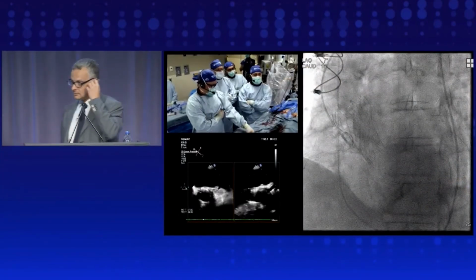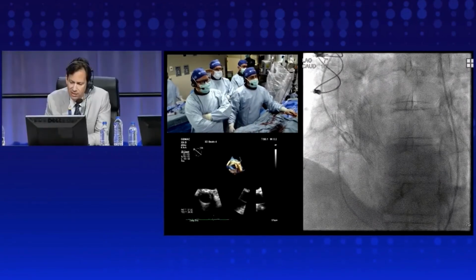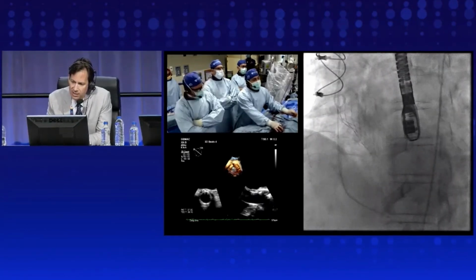There looked like there was a little bit of spasm. I think Tamim's raising his hand of the right coronary distal. It might be worth shooting. To Danny's point, we're just going to wait. We're going to selective one in a second.